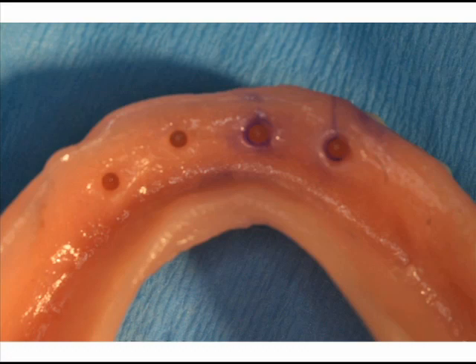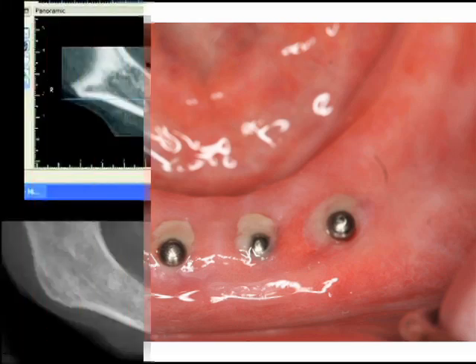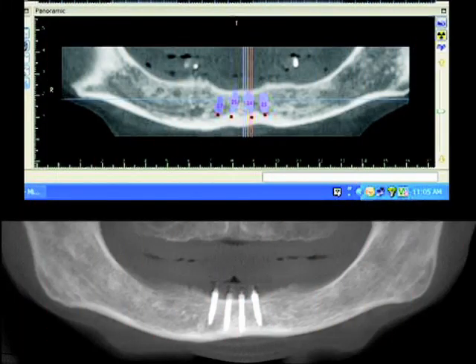Following the stabilization over these implants, the patient experienced immediate improvement of the retention and stability of her mandibular denture. She had minimal discomfort following placement of the conditioning material, and after integration progresses, a new implant-retained mandibular overdenture using the conventional O-rings will be used to create the final proper retention, stability, and dramatically improve quality of life. The final figures demonstrate the post-operative CT scan as compared to the virtual plan, and you can see that they are identical.